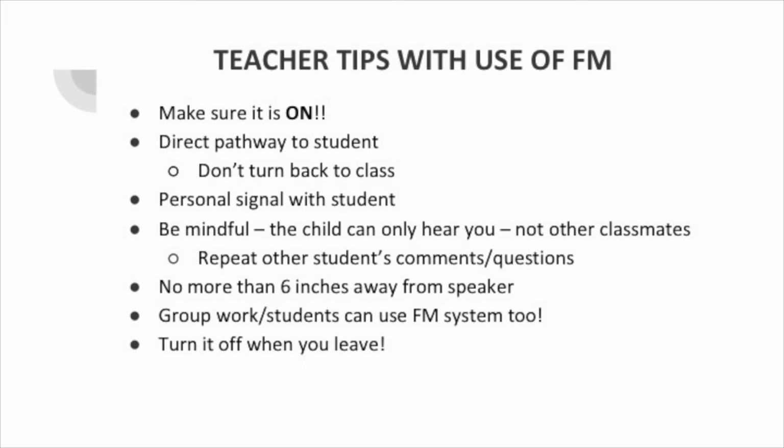And when it comes to the child with hearing loss's turn to read, because he's not heard every other child reading, he didn't know where to pick up. And so these are just tips to be mindful of when constructing your class, perhaps using a remote microphone or having the children come up and talk into the microphone if they're reading something to the class taking turns.